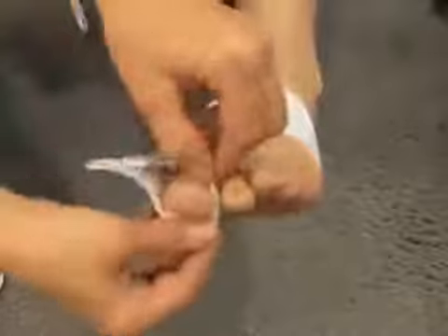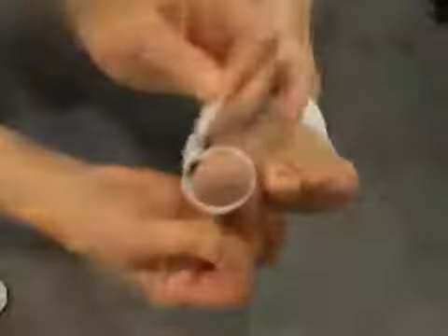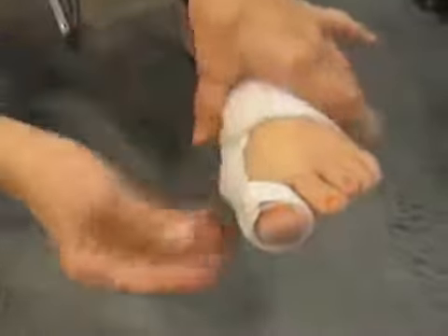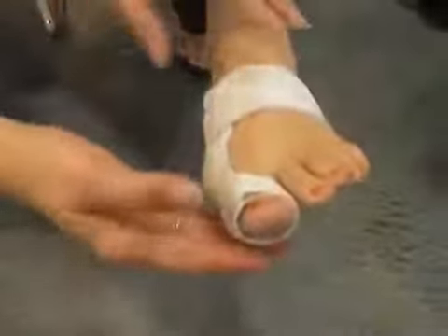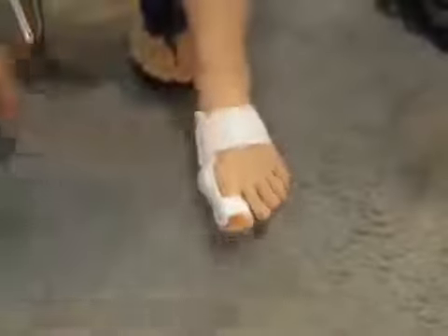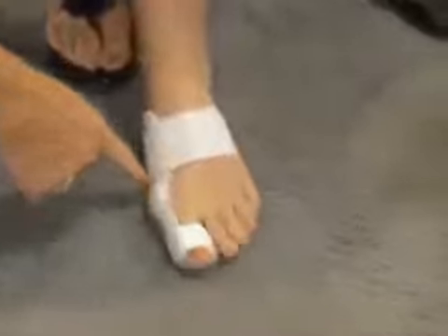Then you put the strap over the toe and tighten it, and it will start pulling the toe over and realigning the big toe along the bunion. What's really important is to walk in the splint because it corrects the malpositioning of the toe throughout the range of motion.